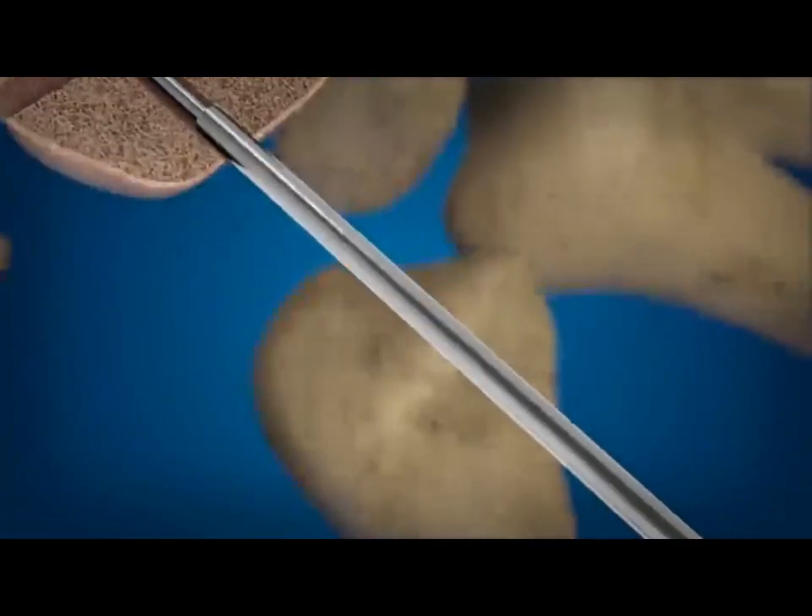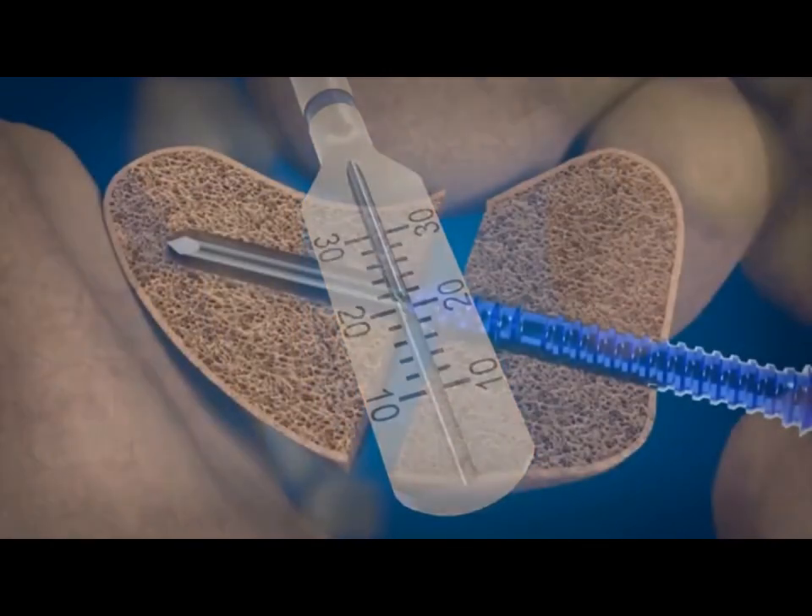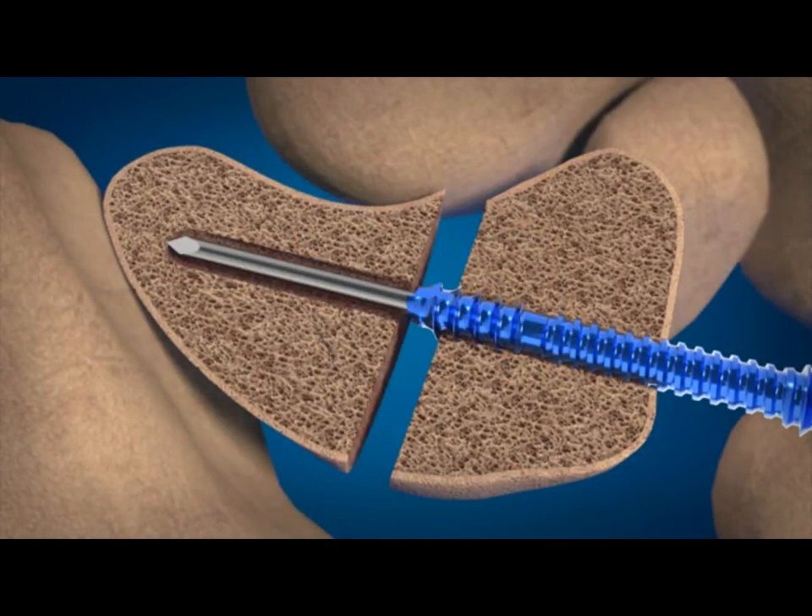The reading on the depth gauge indicates the screw length that will place the screw tip at the end of the guide wire. Advance the screw over the guide wire.